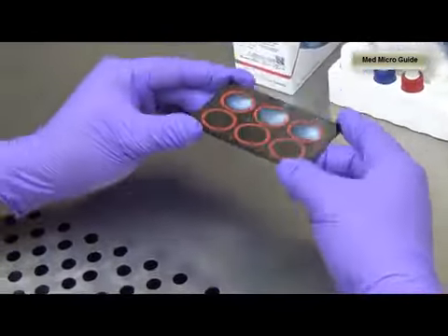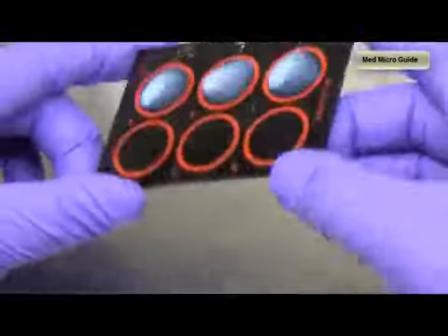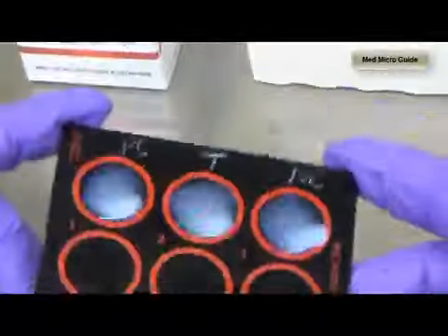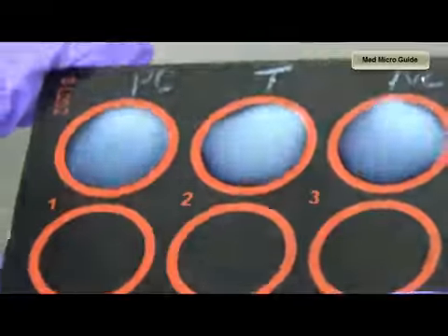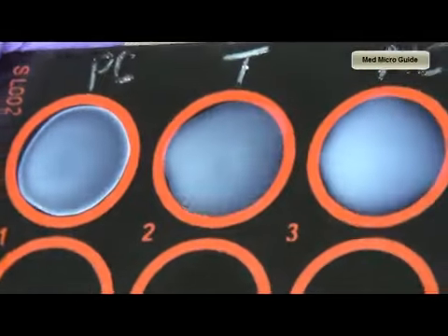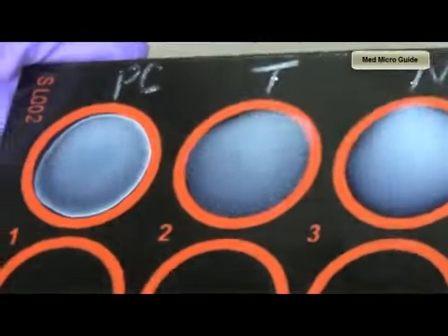After mixing, rock the slide to and fro for 2 minutes. Look for clumping of latex particles in the test sample. If you see agglutination, then it indicates the test sample contains ASO titers of more than 200 IU.